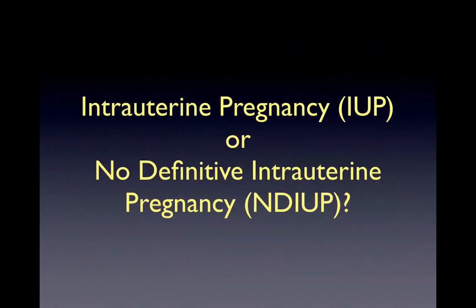Now that you have learned how to perform a systematic transvaginal pelvic ultrasound, we'll move on to our second objective. The following slides will address how to distinguish between an intrauterine pregnancy and no definitive intrauterine pregnancy.